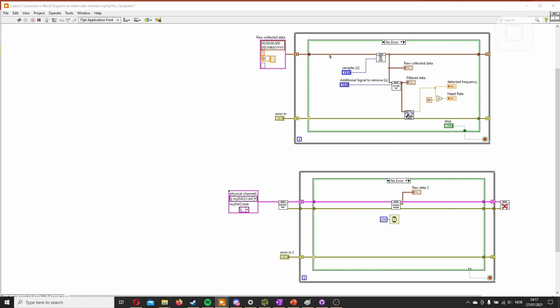I made a mistake by connecting this one in here because this is where the raw data should go in, while this is where the raw collected data should go in. This is because I made the mistake earlier, and having the in and out at different locations made me think that it should go in there if it goes out there.